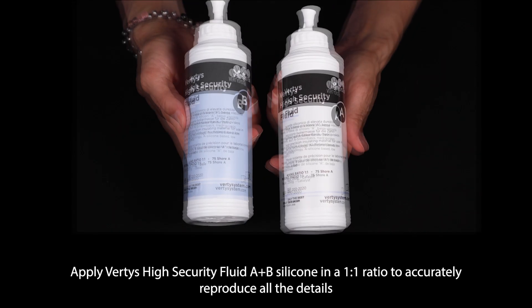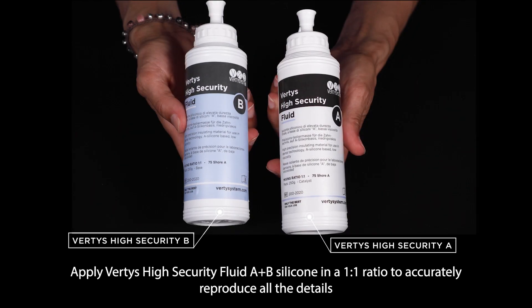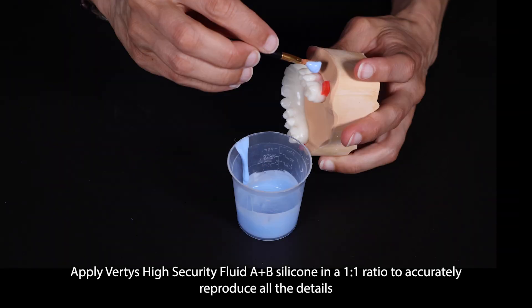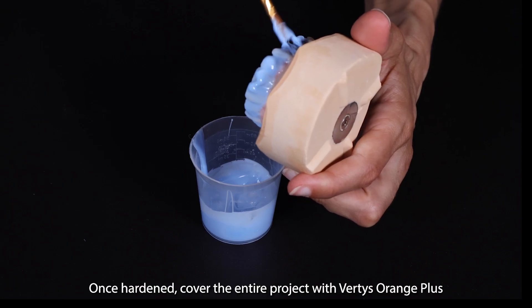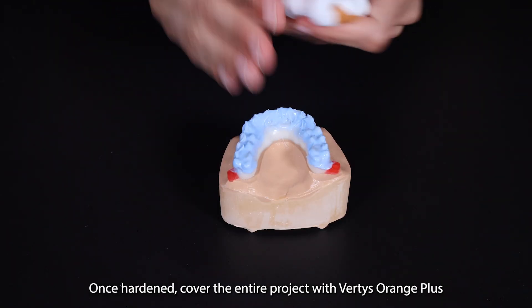Apply Vertis High Security Fluid A plus B silicone in a 1:1 ratio to accurately reproduce all the details. Brush all the teeth with a generous layer. Once hardened, cover the entire project with Vertis Orange Plus.